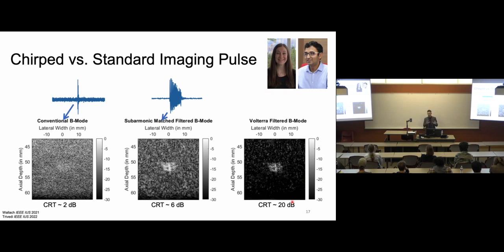And so the point here, and again, all of these images are formed with the same received data, it's just the processing is different. And so the point is, we don't have to suffer through this malarkey where it's very difficult to see the bubble cloud. You can process these in a way where it's very evident to indicate the presence of cavitation. And if I'm using cavitation and bubbles here intermittently, they're both kind of the same, but it's hard to stick to one.